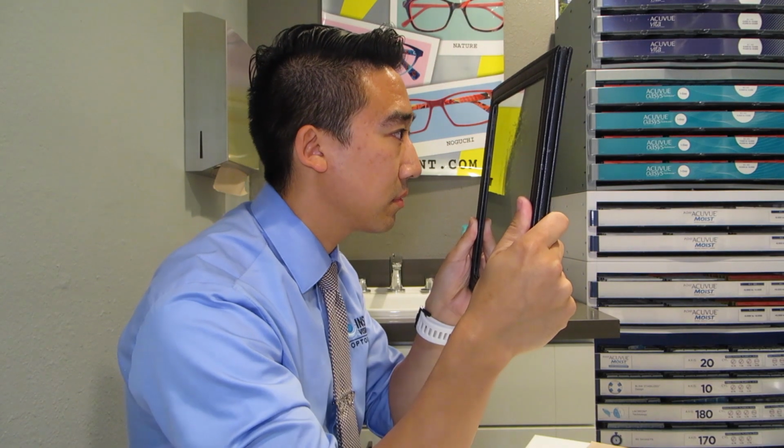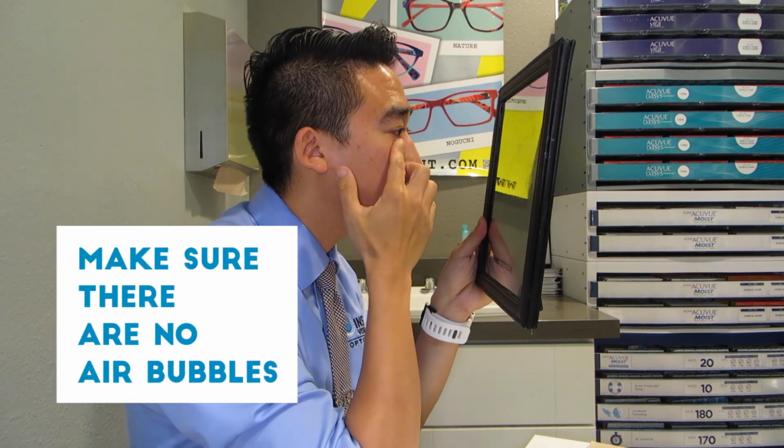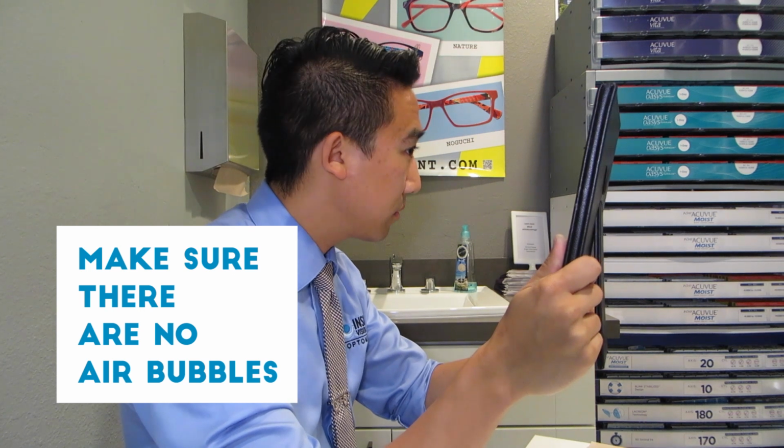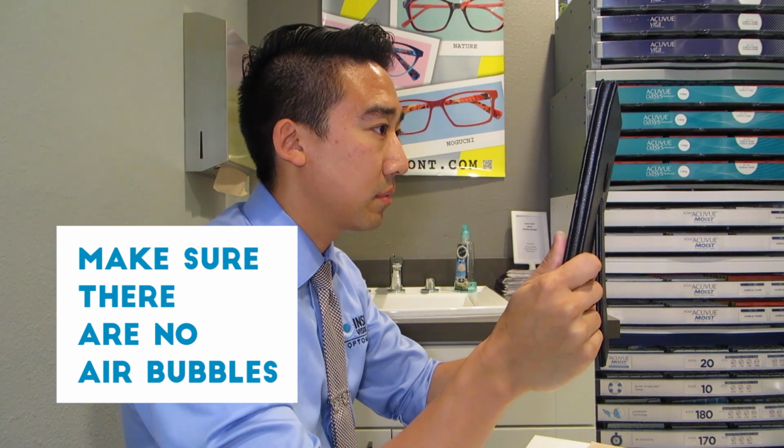Step 9. Inspect the lens on your eye to make sure you don't have any air bubbles in the lens. Air bubbles will cause the vision to be blurry and can cause discomfort during wear time.